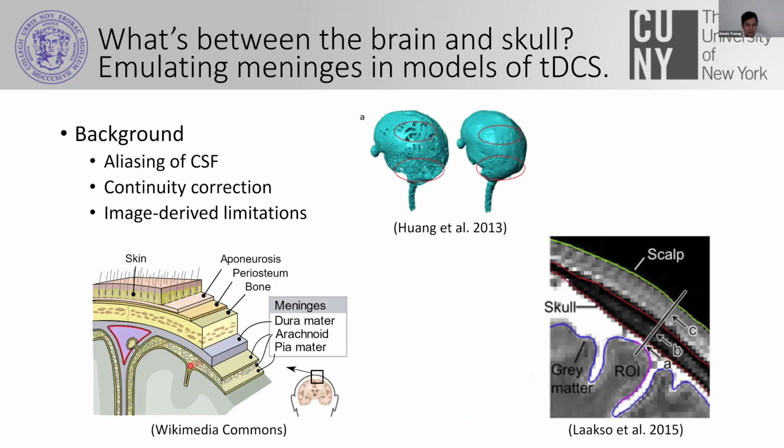So that leads us to a question that we've been thinking about for a while. Most of these scans, we're usually working with clinical scans that we get for some other purpose. If we're lucky, these will be 1 millimeter isotropic. Oftentimes, the resolution might not be as great, or even when it is, it's not always clear, especially at that interface between CSF and skull. In the case of a T2, CSF is at least bright, so you get some contrast between the two, but when you're working with a T1, you have dark skull, you have dark CSF, and these are very, very thin regions.